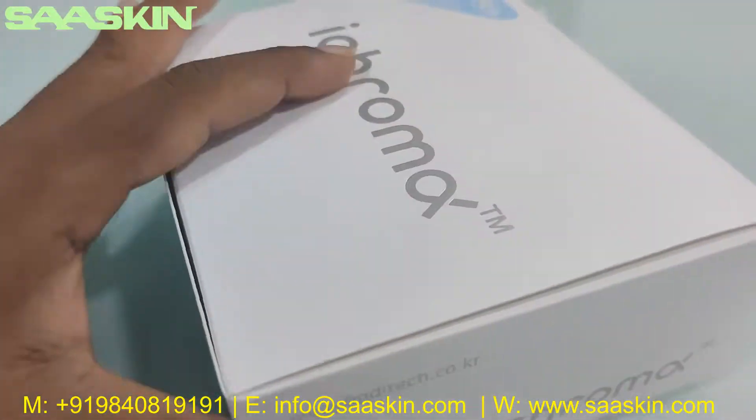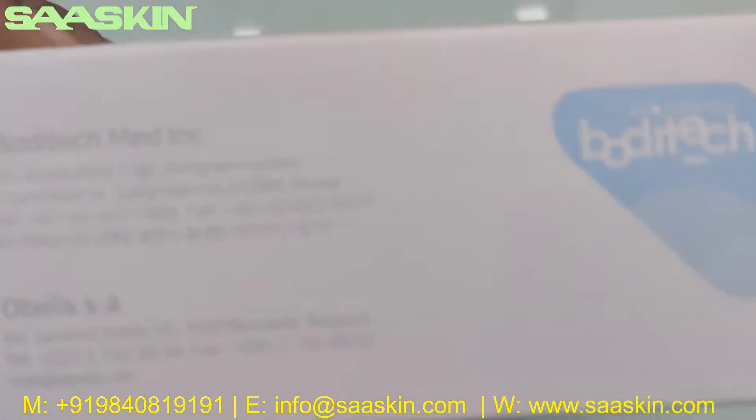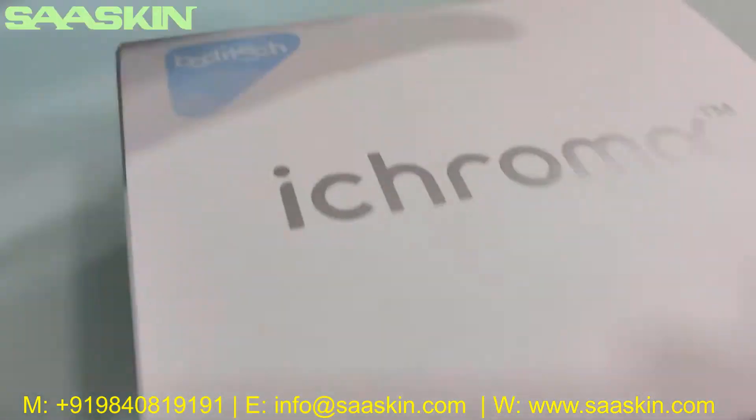Let me go around the box — you can see here that it is manufactured in Korea. Here is the other side, and here it is.